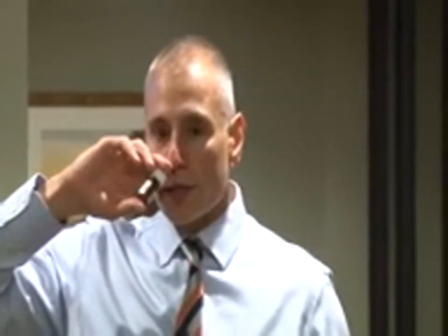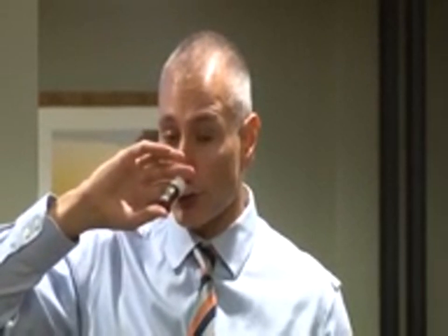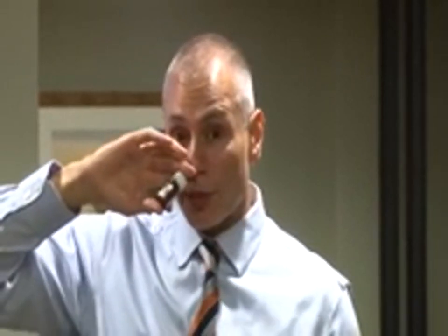Now I see a lot of people use the right hand to spray both sides. And so what happens is that if you're right-handed, the angle is perfect for spraying your left side. It's not perfect for spraying your right side. What happens is that you end up spraying right onto the wall, that septum, which we talked about earlier, the wall that divides the left and the right side of your nose. And if the spray collects there, it tends to cause an irritation. It can cause bleeding. So that's where we get into bleeding issues with some of these medications.